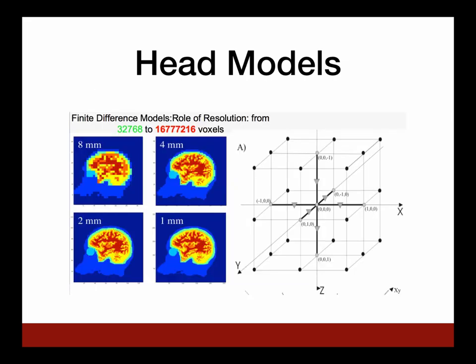More recent head models have tried to be considerably more accurate by parcellating the skull, the scalp, and the brain into voxels and using these voxels each with their own values of conductivity, and these can even be person-specific. It gives us considerably better source analysis that has been verified using intracranial EEG electrodes and also using fMRI on the same participants.